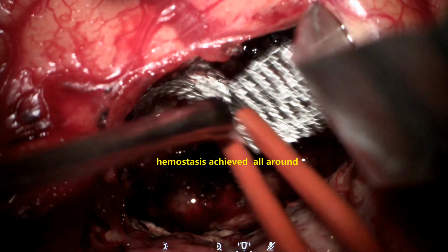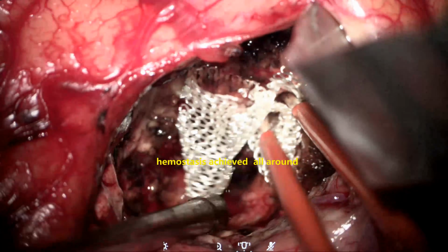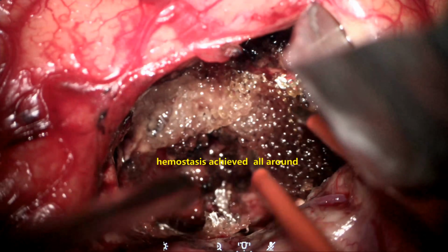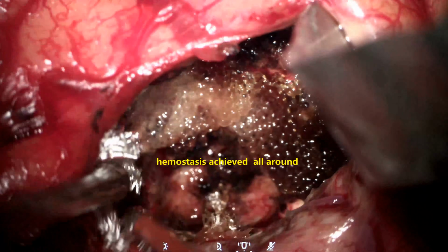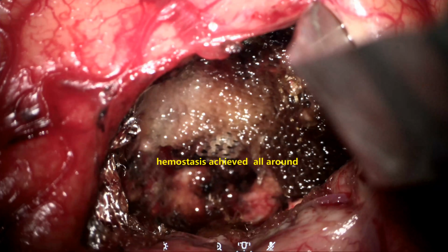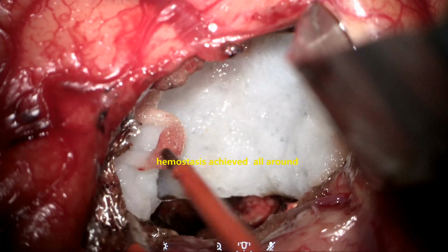So all around, Surgicel is placed because the tumor is quite large, vascular, and necrotic. There are always chances of post-operative bleeding; this needs to be kept in mind. Absolute hemostasis should be confirmed for a minimum of 15 to 20 minutes post-excision, and increasing the blood pressure is of utmost safety for the patient and for us, so that you don't need to re-explore.